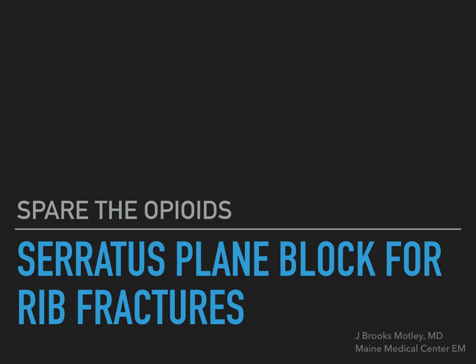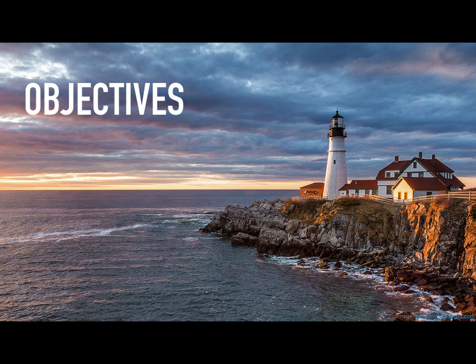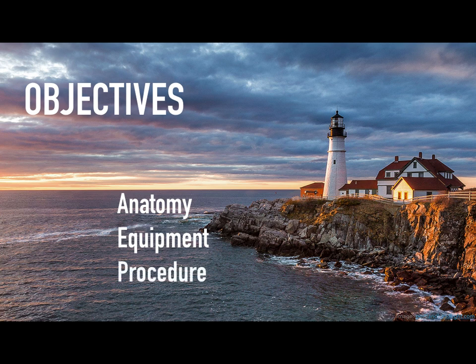It is still a relatively new technique, so published studies are lacking, but there are encouraging case reports in its application for rib fractures, breast surgery, and post-thoracotomy pain. My objectives are first to describe the anatomy we're targeting, the equipment you will need to perform the block, and then some videos of the procedure that I hope are helpful.